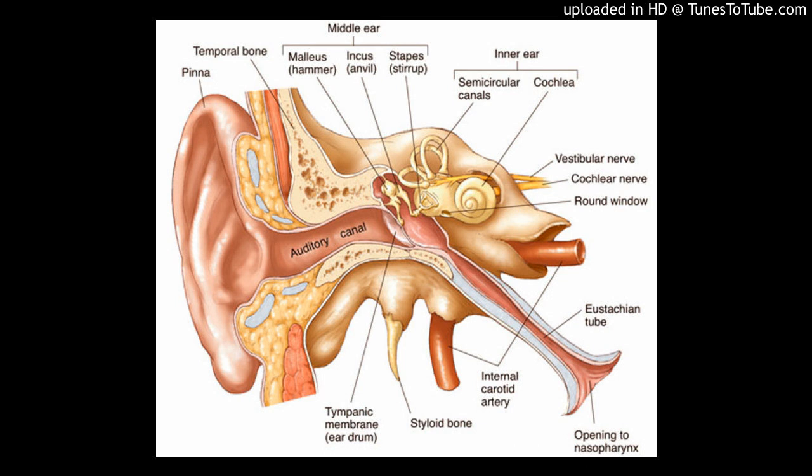Partial obliteration of the mastoid cavity. This can be performed using a wide range of materials. Many of these resorb with time, which means that the long-term results of such surgery are poorer than the short-term results. Reconstruction of the ear canal wall. Canal wall reconstruction has been performed using ear canal skin alone, fascia, cartilage, titanium, as well as by replacing the original intact wall. If the reconstruction is poorly performed, it may result in a high rate of recurrent cholesteatoma.